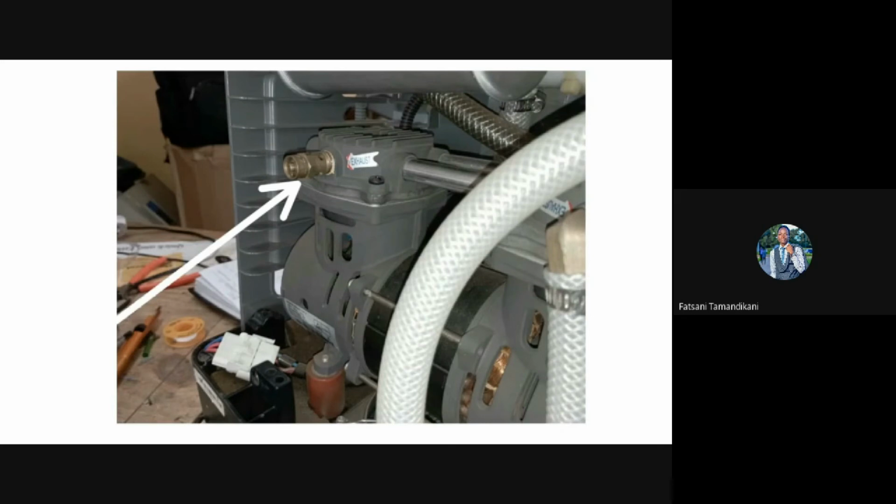In general, a popping relief valve can be caused by blockages in the system, faulty solenoid valves or faulty rotary valves, faulty relief valves, or even contaminated sieve beds. When the zeolite sieve bed has been contaminated with water, it becomes clogged, and this can result in a pressure buildup, which can trigger the relief valve. In the graphics, there is the relief valve on a compressor in a DeVilbiss 525 concentrator.